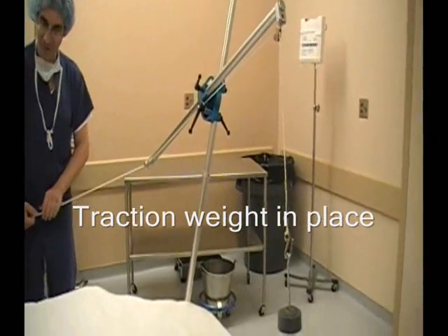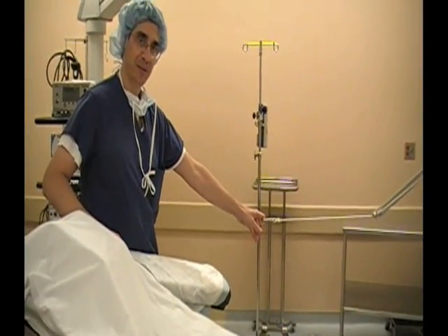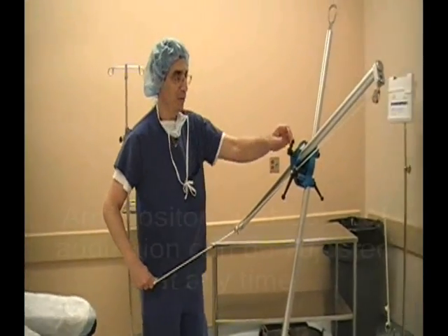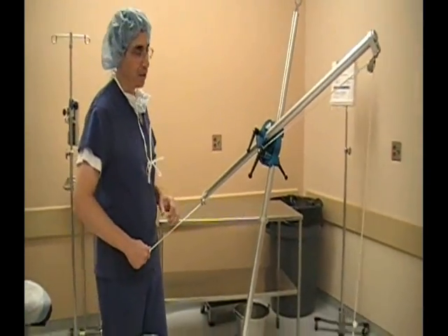Let me show the weight — yes, right here. And if the patient is lying down, the arm will be in traction in this manner. At the same time, during surgery, if you wanted to lengthen or shorten the arm, you could lengthen or shorten it to adduction or abduction.